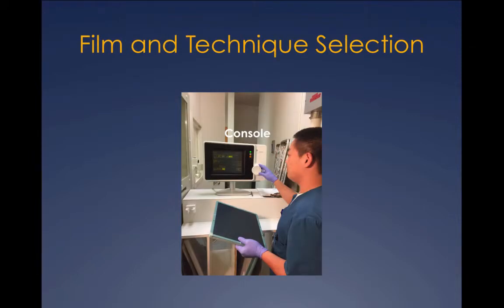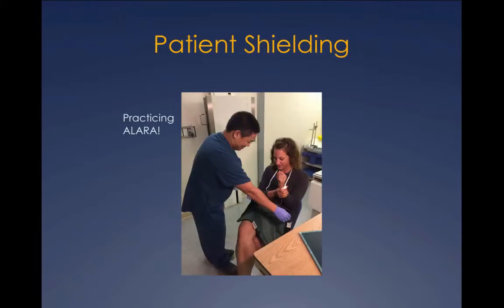Next, you'll select the film size that's appropriate for the part being imaged and select a correct technical factor from the console. Make sure next that you shield your patient, always practicing the concept of ALARA, as low as reasonably achievable, when it comes to radiation dose.